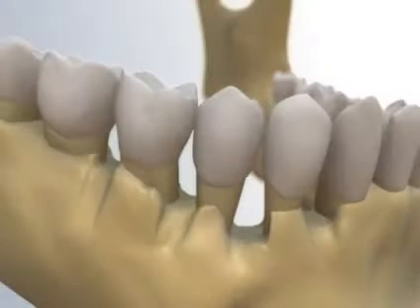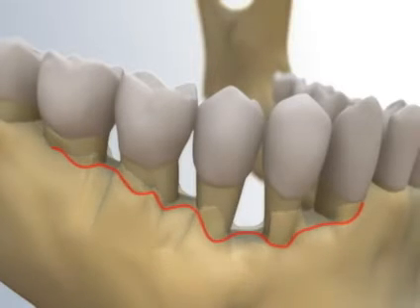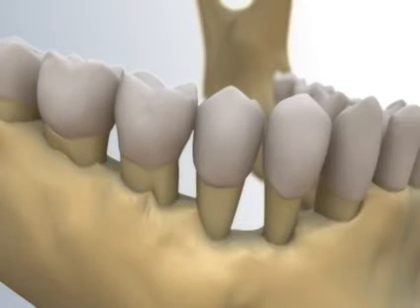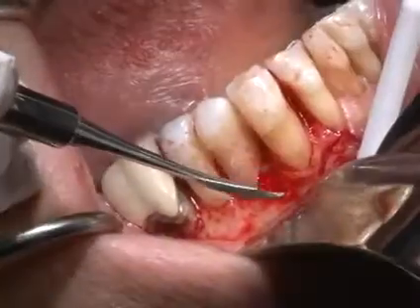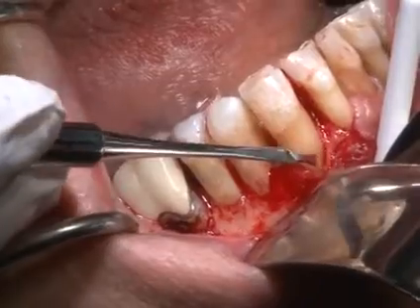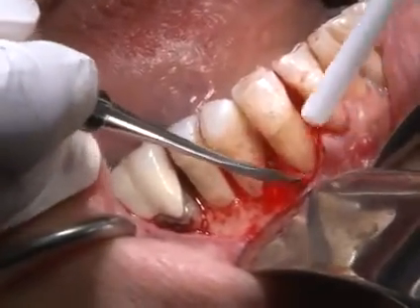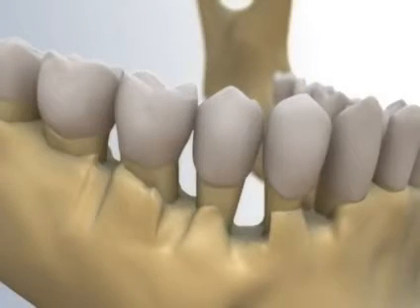The final step is gradualizing marginal bone. This is necessary for providing a well-contoured base for the gingival tissue to follow. The floor of the interproximal osseous crater will become the height of the newly created osseous septum. Therefore, the buccal and lingual marginal bone is resected so that it is more apical than the interproximal bone, thus achieving a positive architecture. The buccal and lingual marginal bone on teeth 4-4 and 4-5 is more coronal.